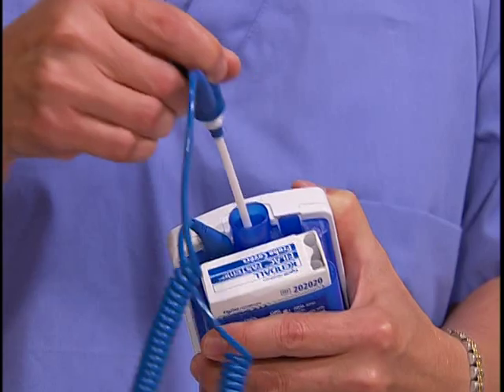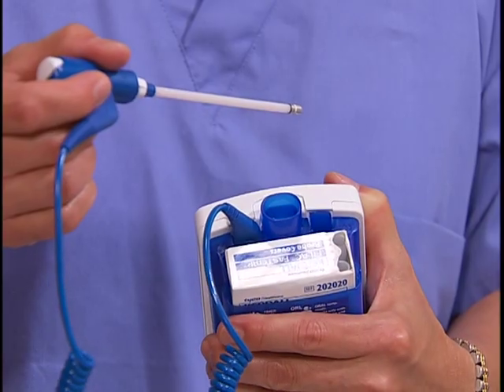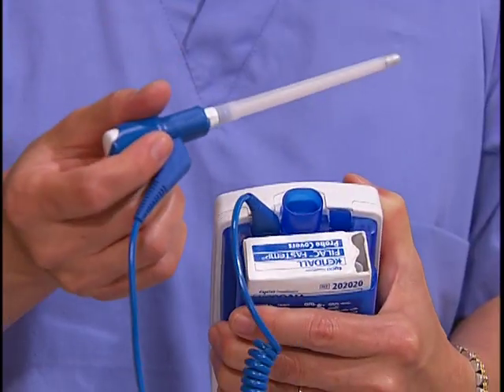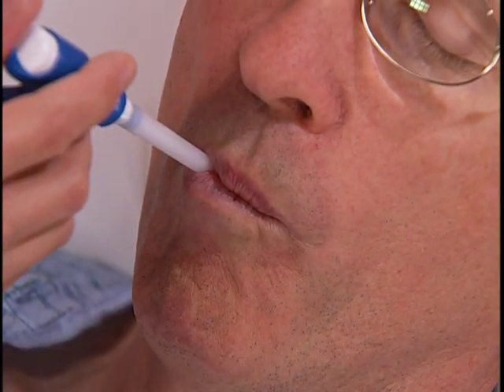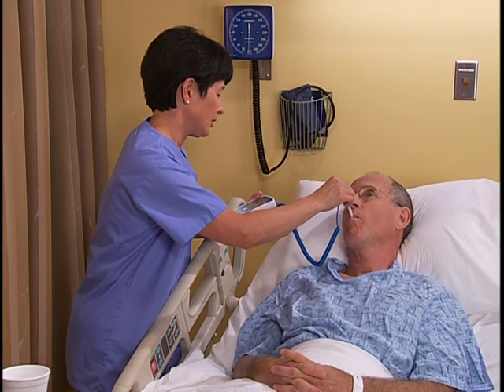For an oral temperature, remove the thermometer from the charging unit and grasp the top of the blue tip oral probe, avoiding pressure on the ejection button. Then slide a disposable cover over the probe until the cover locks into place. Ask the patient to open his mouth, then gently place the probe under his tongue in the posterior sublingual pocket and have him hold the probe in place with his lips closed.